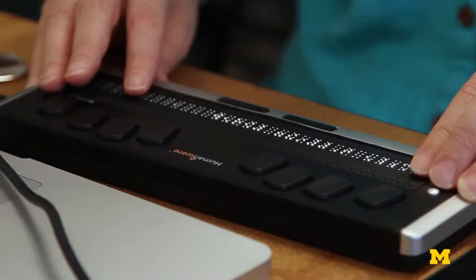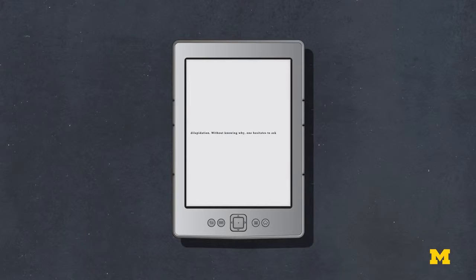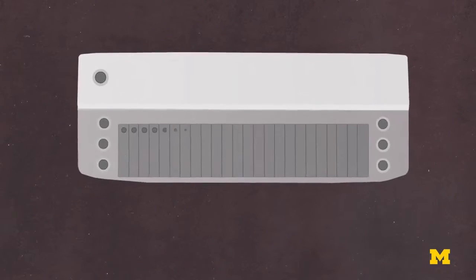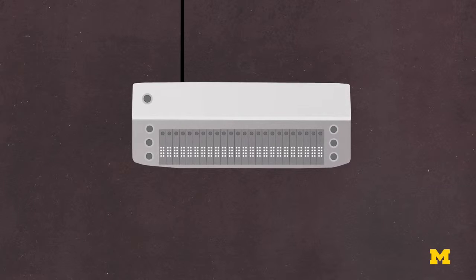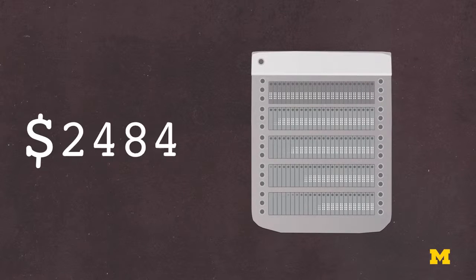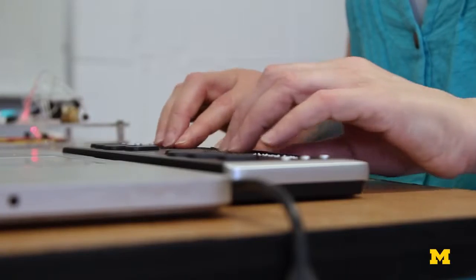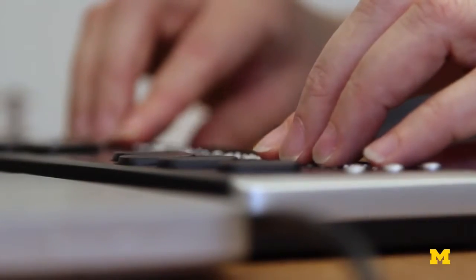The first is that they only display one line of text at a time. So if you can imagine trying to read a book on a Kindle, one line of text at a time. The second is that they're extremely expensive. A single line of braille typically costs between $3,000 and $5,000, and a full-page braille display would cost somewhere in the region of $55,000. Blind people currently only have access to a single line of braille with these digital devices, and you can't do much with a single line.